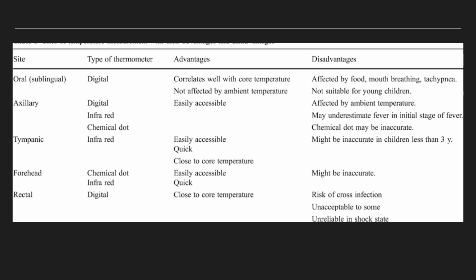If this route is used, take care to avoid placing the thermometer into fecal material, which may elevate the temperature reading falsely. The rectal route is contraindicated in clients with diarrhea, those who have undergone rectal surgery, those with rectal diseases, and those with cancer who are neutropenic. In selected clients, like quadriplegics, rectal temperature measurements may cause vagal stimulation, which can result in bradycardia and syncope.